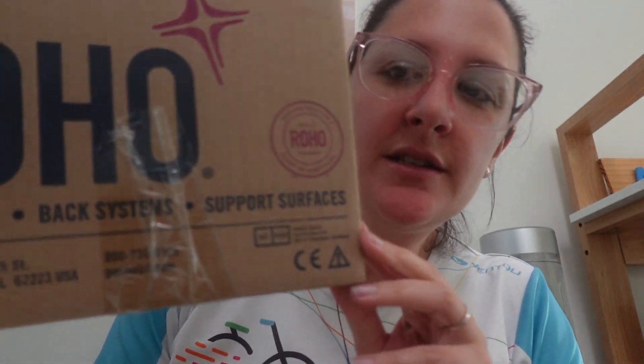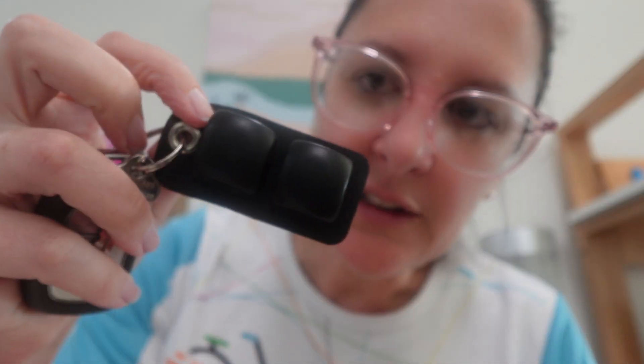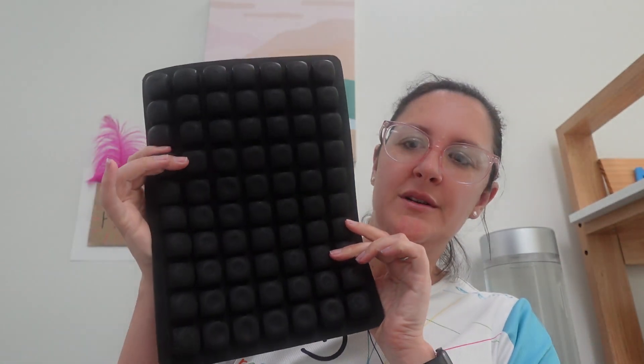Hi everyone, OT Nikki here for another week of AT Fridays. Our product this week is the Roho adapter pads — it comes in this box. OTs and physios, you may be familiar with the little Roho key rings that you can get. We have our work keys on a Roho key ring pad. However, these are actually cut from a Roho adapter pad.